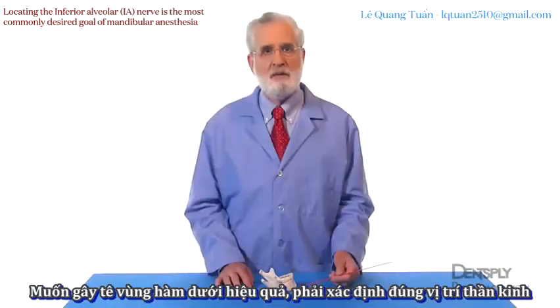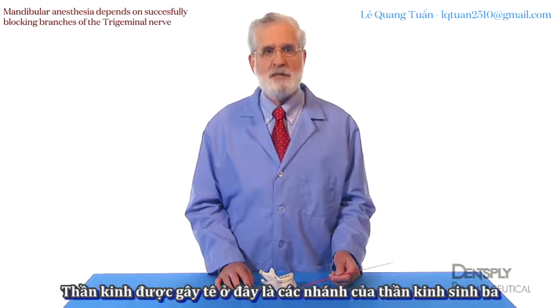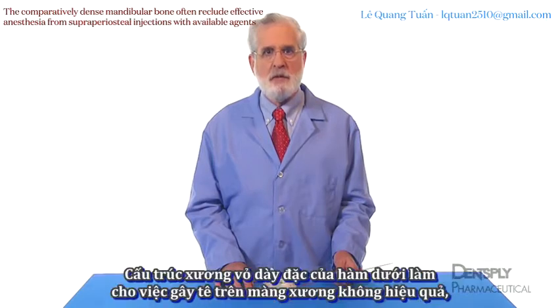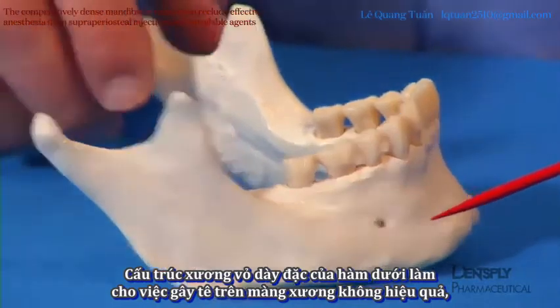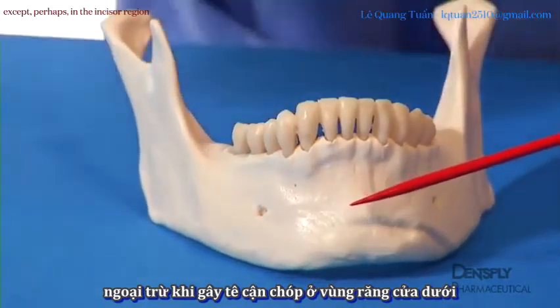Blockade of the inferior alveolar nerve is the most commonly desired goal of mandibular anesthesia. It is also one of the most difficult blocks to achieve. Mandibular anesthesia depends on successfully blocking branches of the trigeminal nerve, especially the inferior alveolar nerve, which supplies mandibular teeth and surrounding soft tissue. The comparatively dense mandibular bone often precludes effective anesthesia from supraperiosteal injections with available agents, except perhaps in the incisor region.